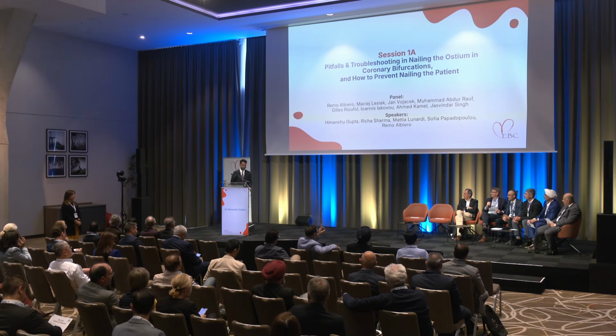So go in higher speed. Not less than 160. You don't want to go low speed here. You want to go high speed, use a bigger burr, and create as much heat as you can to achieve what you did. So that was an amazing case. But don't push too much. Not to just keep it there. It will go by itself. Not to wedge the burr.